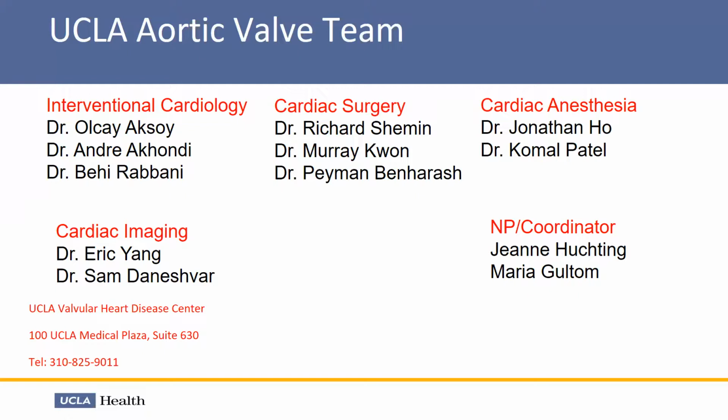Olcay, on top of your stellar leadership in this program, going back to the CoreValve, Sapien divide, I'm wondering about your work with the EP group, looking at EP properties. Full disclosure, I'm not involved in that project, so I don't know the details, but do you think you could potentially risk stratify the risk of pacemaker with that? It's a very unique project, and it could provide a lot of TAVR groups with guidance if you suspect someone, let's say with right bundle branch block or at high risk for conduction disease, and they have the choice of two devices, and also factoring in things like coronary height. That could be a way to help figure that out. I agree with you that you probably get better hemodynamics in valve-in-valve or prior device therapy, but I don't know if you're allowed to comment on that.